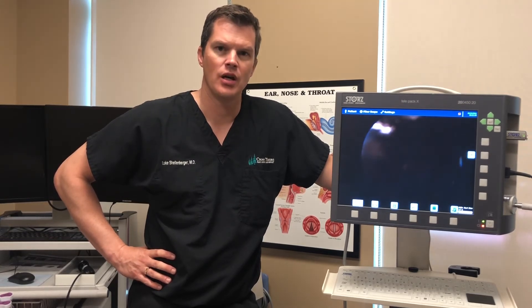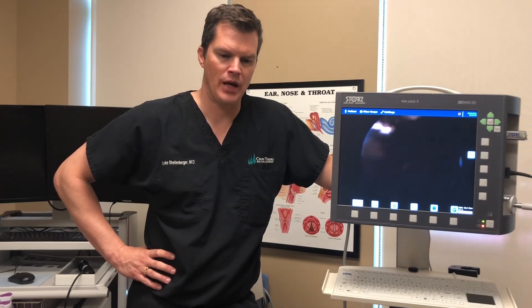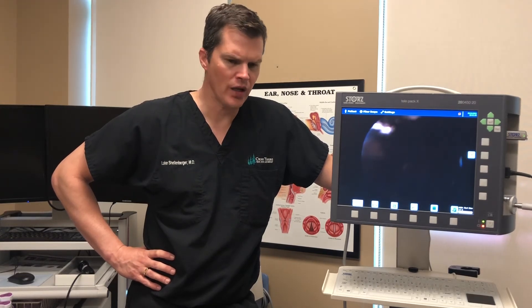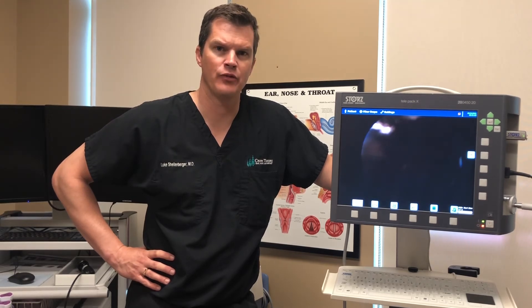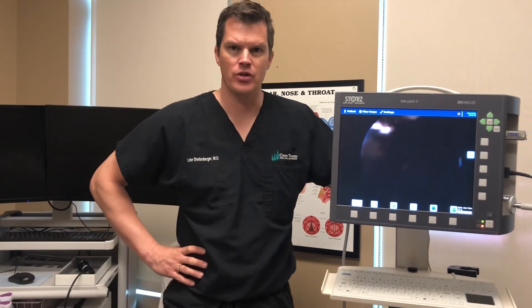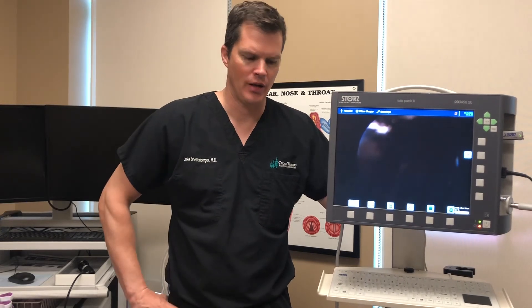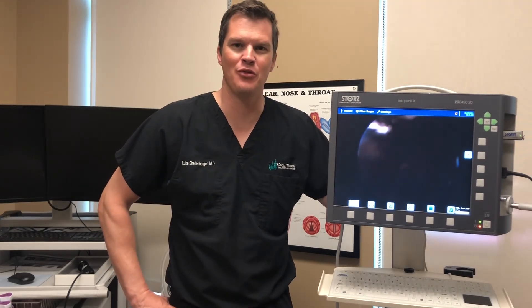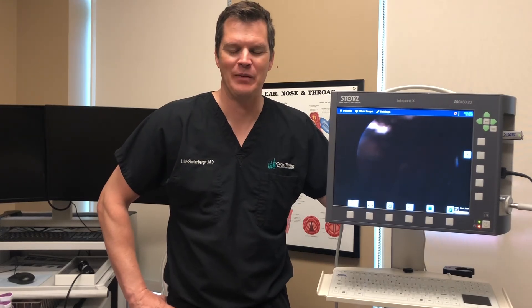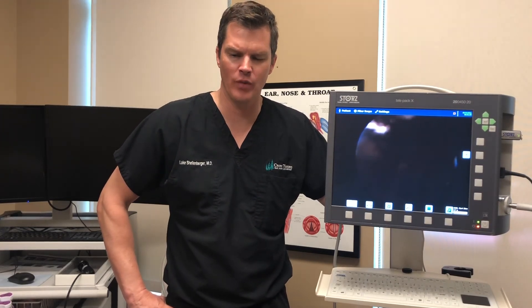Certainly there are ways we can manage inferior turbinates both in the office and in the OR from a surgical and procedural standpoint. We'll talk about some of those procedures and expectations after those procedures in future videos. I wanted to show you what exactly we're looking at from an anatomic standpoint by looking at my own nose — I'm better at doing scopes on other patients than myself. We'll talk more about the inferior turbinates in future videos.